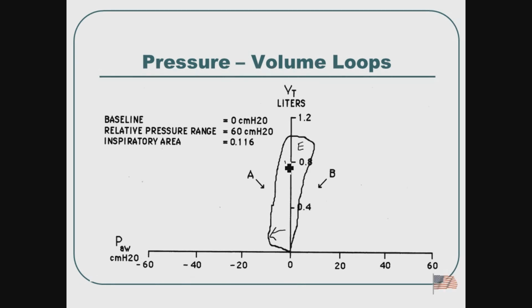So this is the expiratory phase, this is the inspiratory phase. Now the weird part about this tracing is it's probably taking close to 10 centimeters of water to trigger it on. Or not to trigger, let me rephrase that. They're generating a pressure of 10 centimeters of water. That's an awful lot of pressure. Normally you would only see a smaller drop back. So there's something related to why they were requiring so much water pressure to generate a breath. But that's a pressure volume tracing, and I know it's a spontaneous simply because it's got a big negative component.